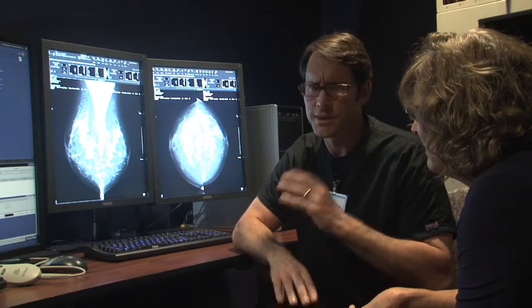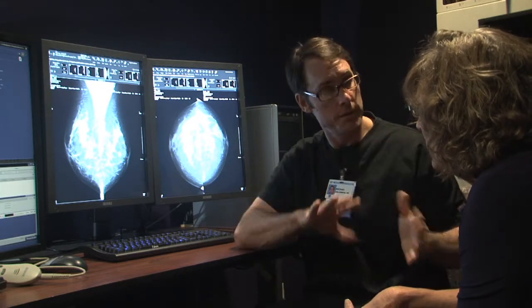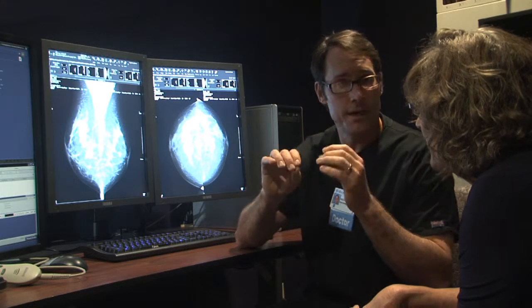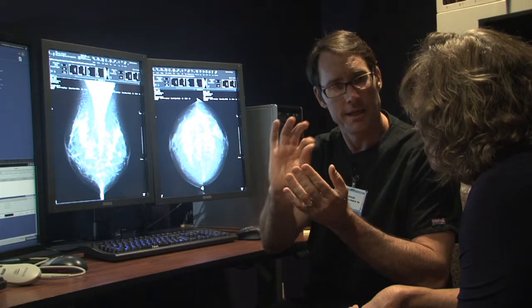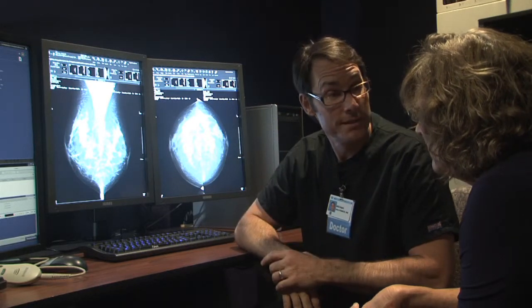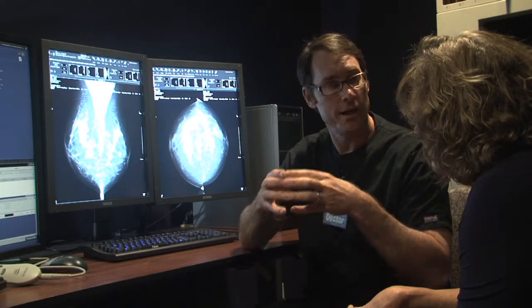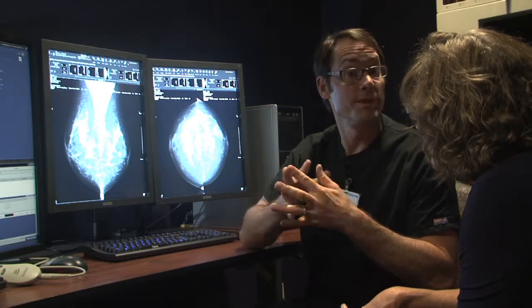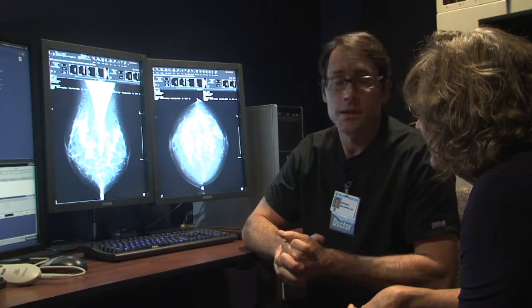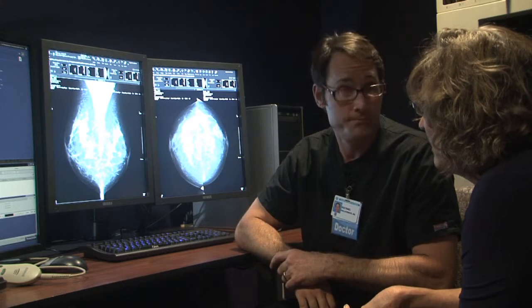Is that going to hurt? Now, it sounds like a big thing, I understand, but we actually do it here. We all work together, we make you extremely comfortable, and we actually use X-ray to triangulate and target these calcifications. The needle will go in, remove that tissue. We'll actually take an X-ray of the tissue to show that the calcifications are there, and then we'll discover what's happening here. Is it going to hurt? There's a bit of pain initially as I give you the lidocaine, and after that, I'll give you so much lidocaine that it shouldn't hurt at all.